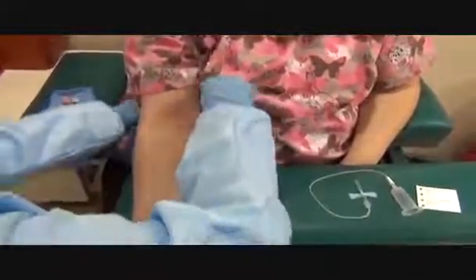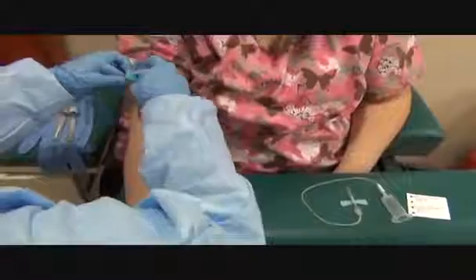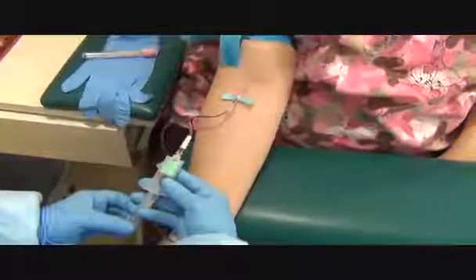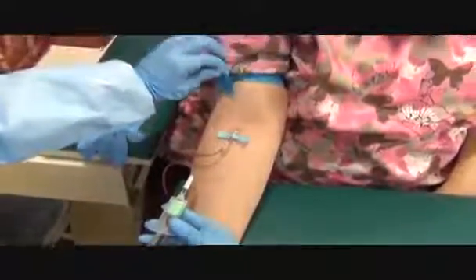Does it feel dry? Yes. Tie the tourniquet four inches above the site again. Make a fist. Put your arm straight. I want to make sure I hold the wings, anchor the skin, and thread the needle in. I got a flash of blood. Before I let go of the wings, I want to grab my hub. Let it go. Make sure I get a good flow before I pop off the tourniquet. I'm getting a flow. I want to make sure it fills from the bottom up so I don't have any reflux. Pop the tourniquet.